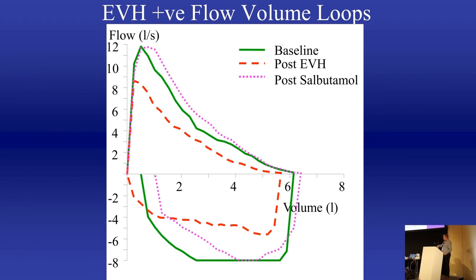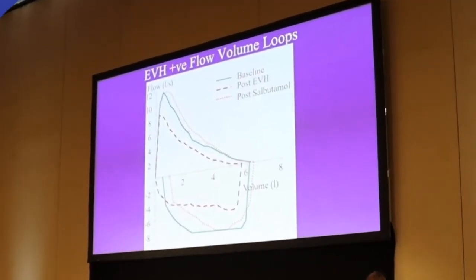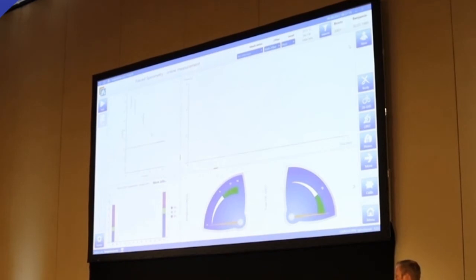Okay. 20 seconds, so we just prepare. We switch over to the spirometry device. So, good. This is now coming from the spirometer, and we can do the test. 3 minutes are over right now. Just do the spirometry testing of the flow volume loop.